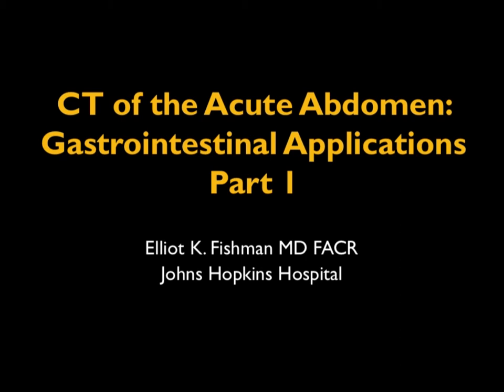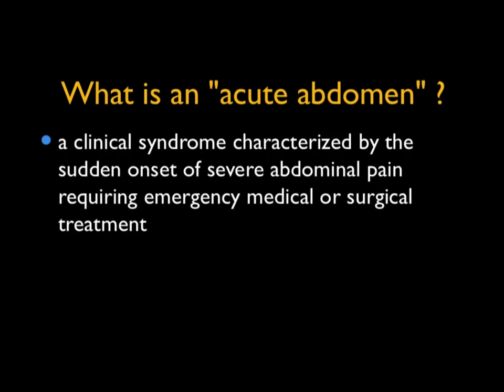And this will be CT of the acute abdomen, GI applications. And what I'll try to do is cover some interesting topics, recognizing that if I spoke about the acute abdomen, I could be giving you about 20 hours of lectures. So we're just going to try to do this in a couple parts and just do a few basic principles and a few applications. So first of all, what's an acute abdomen?